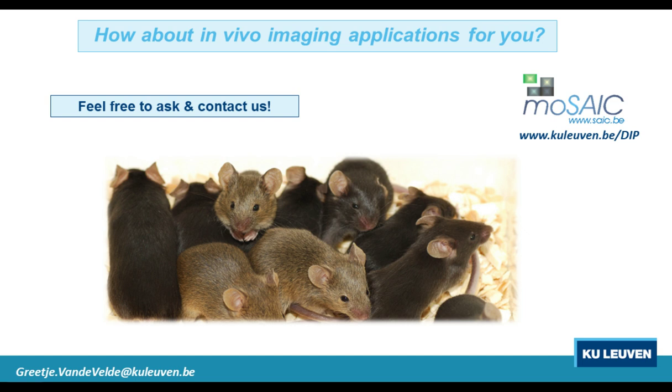So that's really nice. And then also, to give an example, the way we analyze the lungs is something quite easy to do. It's a bit time consuming because we manually delineate the lungs, but once you have that, it's very easy to extract all the biomarkers. The morphometric analysis is of course a bit more tedious, and this is really a specialism, and for that I'm really lucky to collaborate with Neus. That's really her expertise. So if you want to do that, you can find a collaborator that's expert in that. But apart from that, there is a lot that you can do just with the software delivered with it and the freely available software like Fiji and ImageJ and so on.